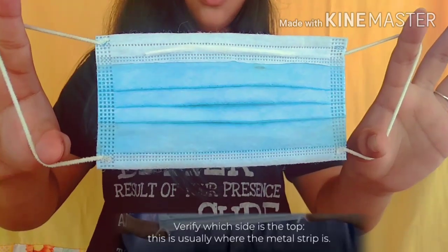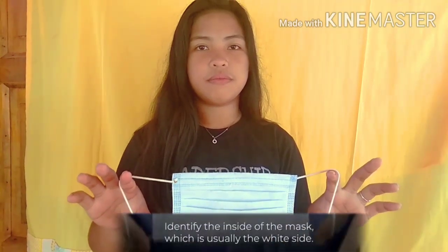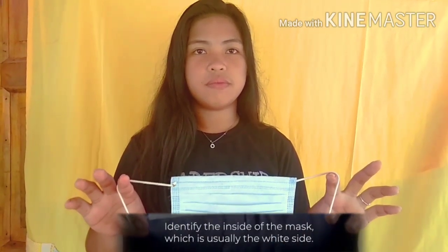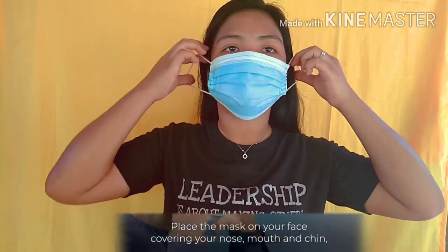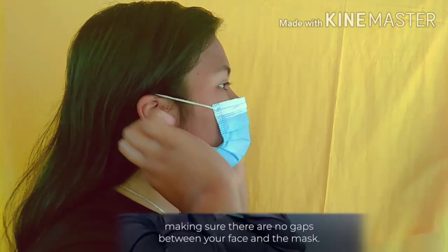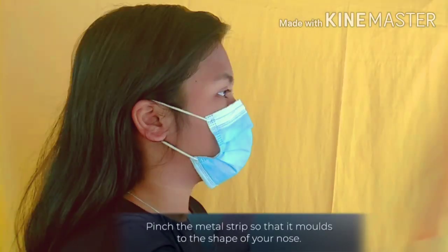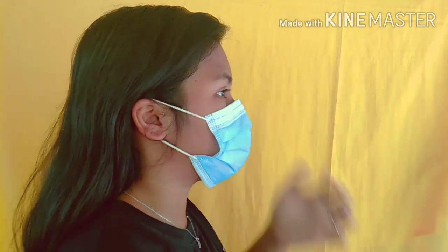Verify which side is the top — this is usually where the metal strip is. Identify the inside of the mask, which is usually the white side. Place the mask on your face, covering your nose, mouth and chin, making sure there are no gaps between your face and the mask. Pinch the metal strip so that it molds to the shape of your nose.